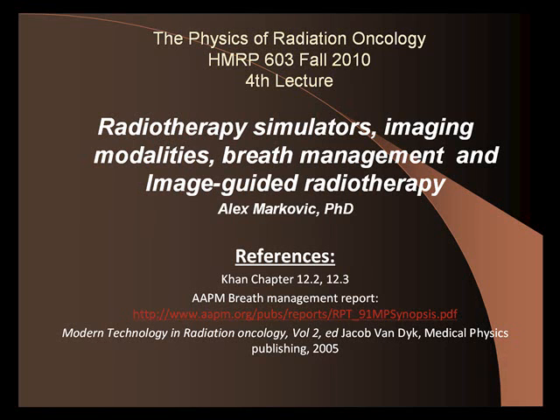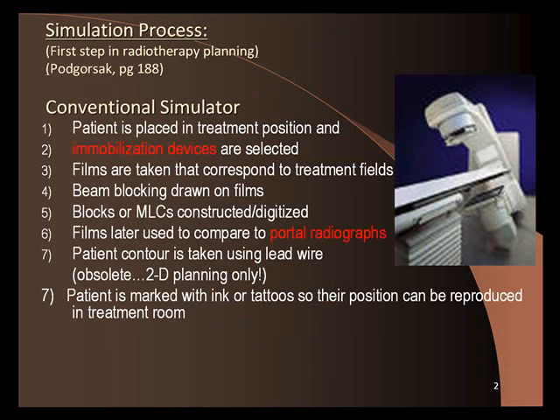Okay, so today we're moving away from linear accelerators and we're going into the radiotherapy simulators, imaging modalities, breath management, and image guided radiotherapy. Lots of topics here. So let's get started. So first of all, simulation and the simulation process.